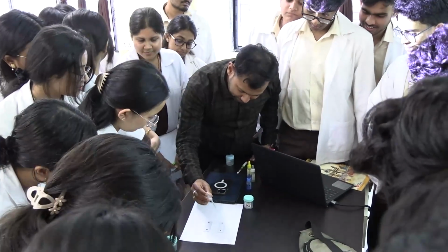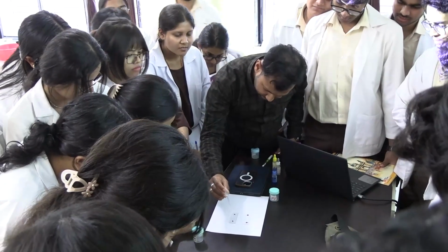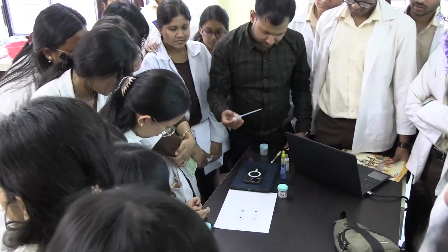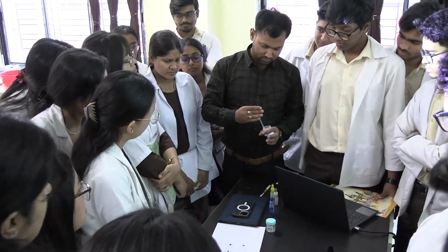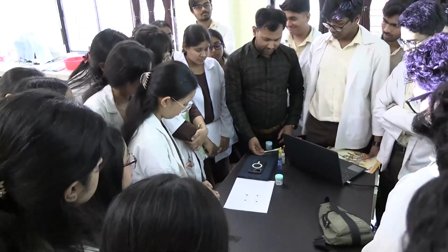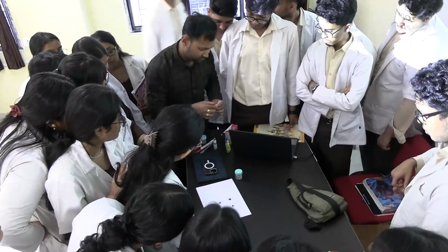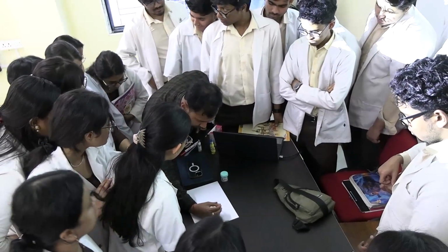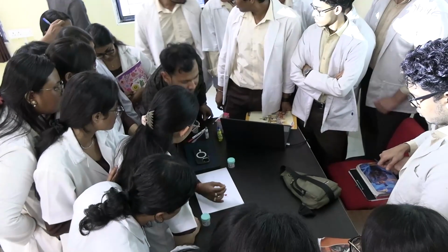Then we will add 1 drop of normal saline. Why are we giving saline?